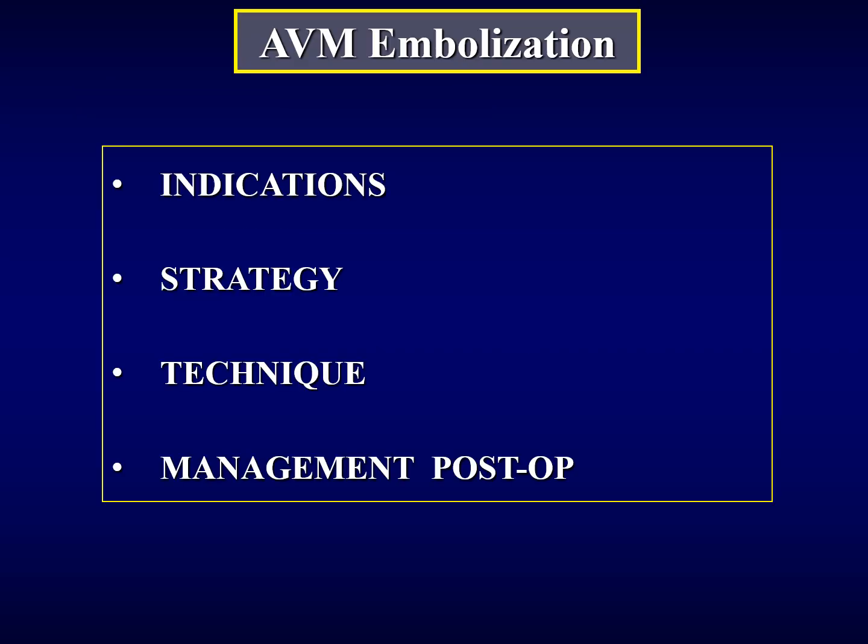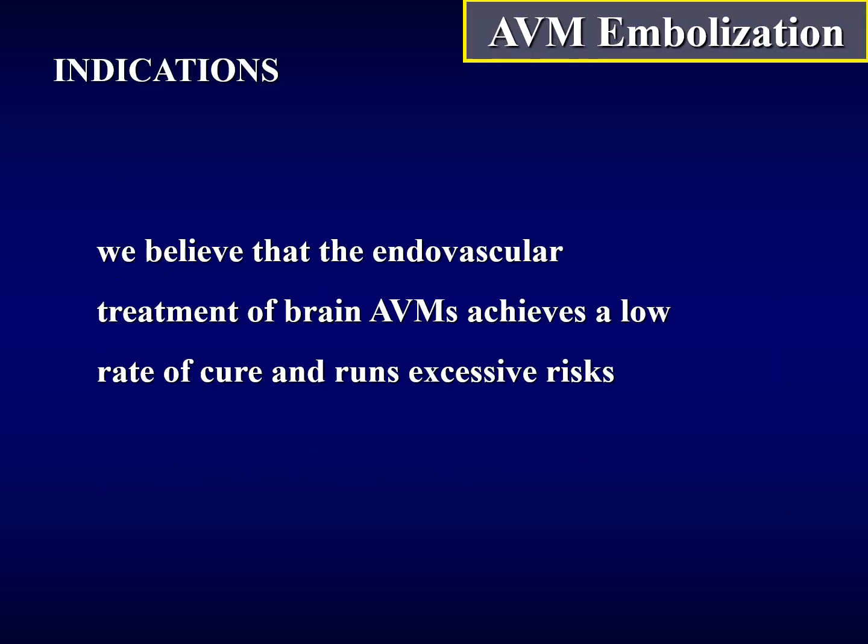My talk will be about indications, and then we'll follow with strategy, technique, and management post-op in AVM embolization. I guess the most important thing is indications. And we believe that the endovascular treatment of brain AVMs achieves a low rate of cure and runs excessive risks. This is the starting point.